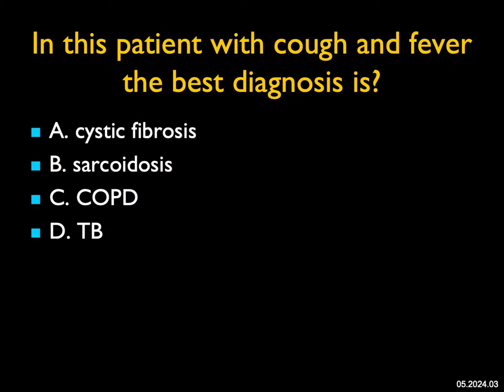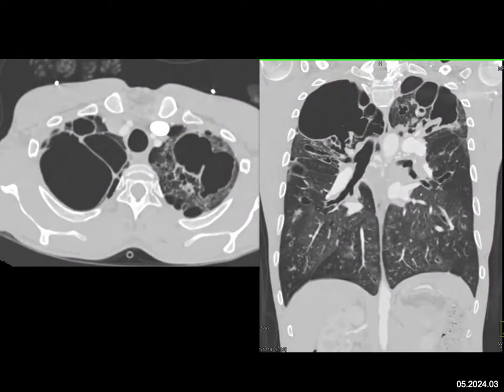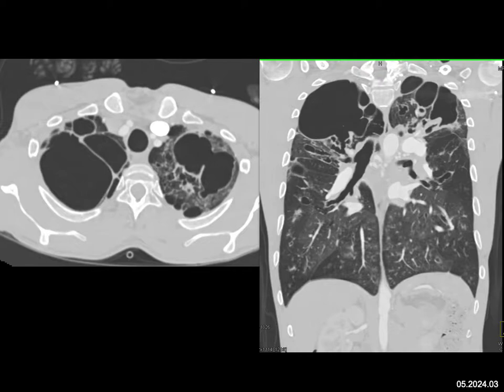In this patient with cough and fever: if you look only at the axial views, you see cystic changes with lots of destruction of the lung fields — many possibilities. When you look at the coronals, the real destruction is mainly in the upper lungs, but there are cystic changes in the bronchi throughout the lung with multiple areas of air trapping. Sarcoid can give you scarring and retraction of the bronchi, but that's not really what you're seeing here. COPD is always a thought, but the dilated bronchi and distribution don't really fit.